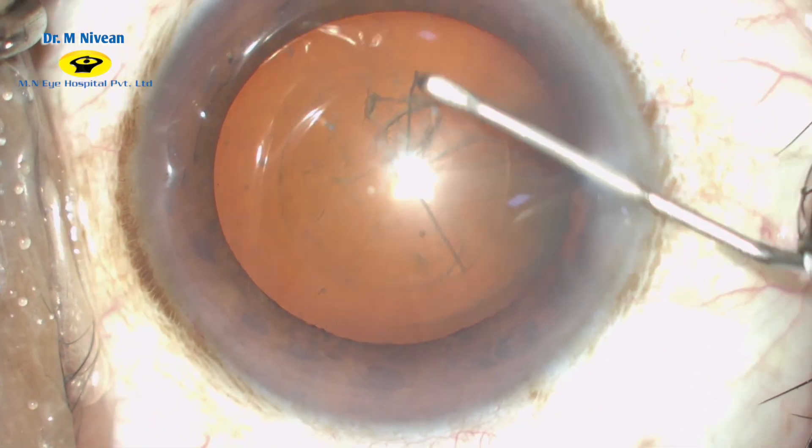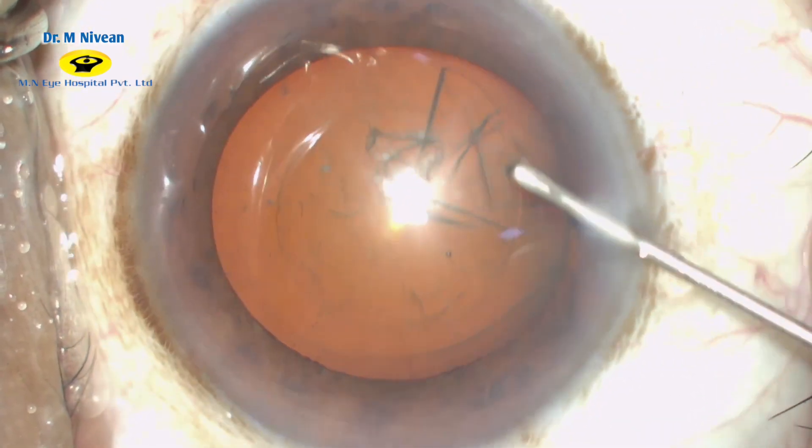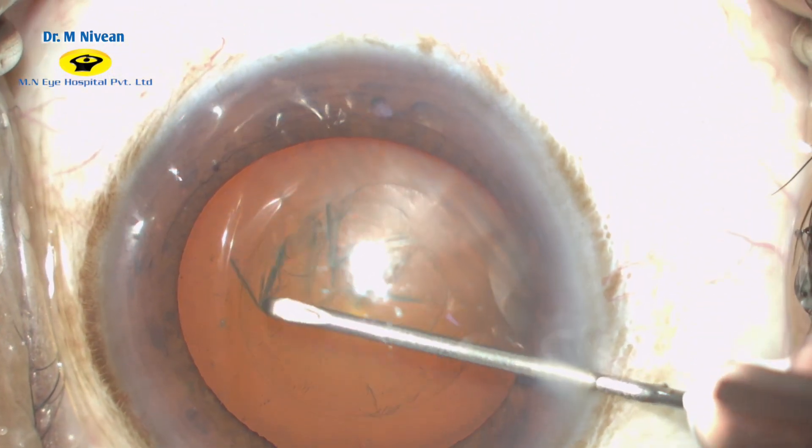The flap should remain folded to avoid a runaway while coming sub-incisionally. The final pull of the capsulorhexis flap should be towards the center to get a circular, well-sized rhexis.